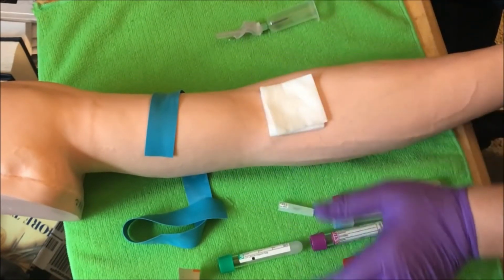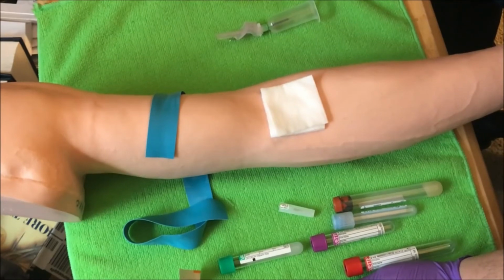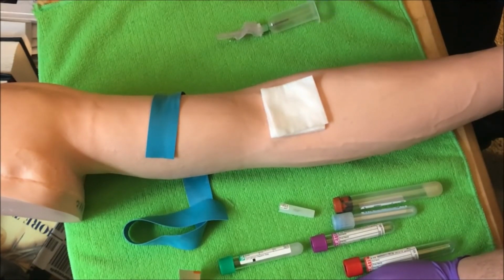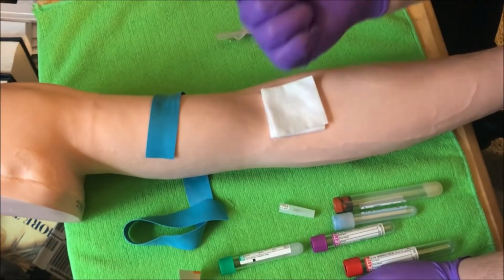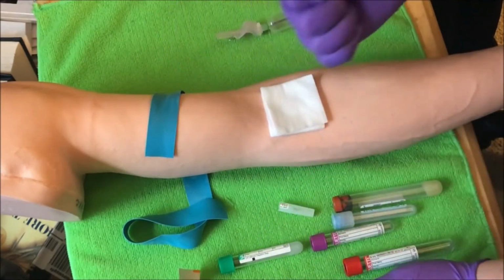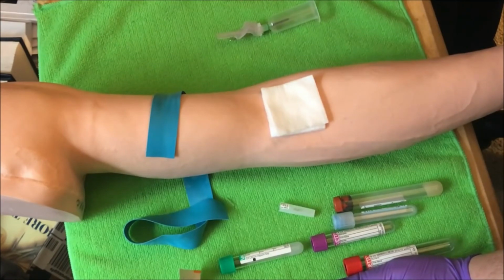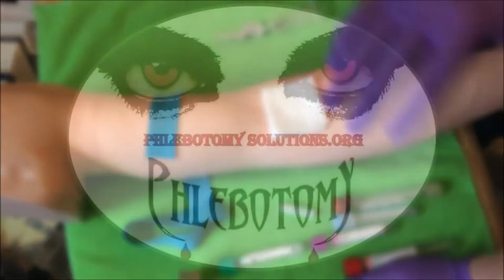I let the patient know to not lift anything heavy for at least an hour. I tell them to keep the bandage on for at least 15 minutes. Again, this is post-care instructions. And I tell them that if you lift anything heavy within the hour, you can cause bruising, because again, the weight on the arm that they've just punctured can cause bleeding on the inside with pressure. So I tell them no lifting for 1 hour. Keep the bandage on for at least 15 minutes. All right, and of course I assess the patient to make sure that they're able to get up and walk and they're fine. Remember that.